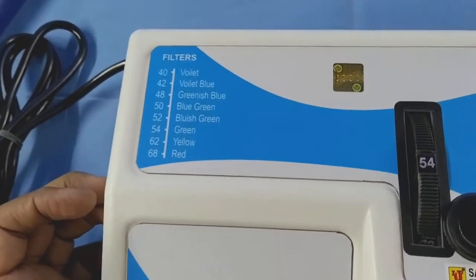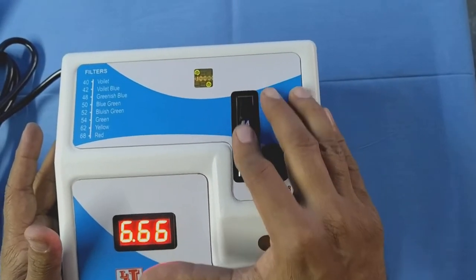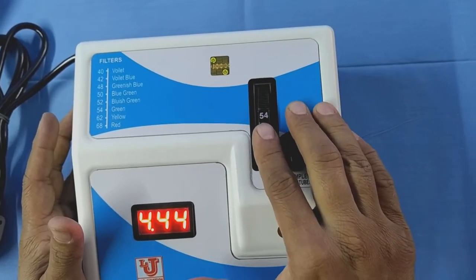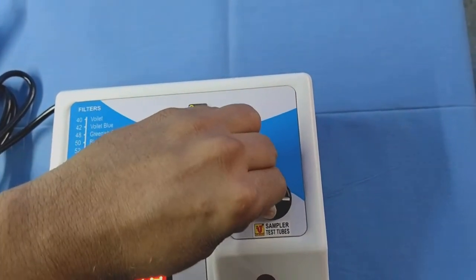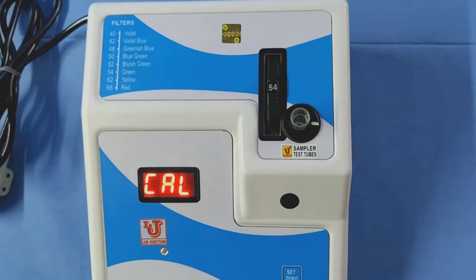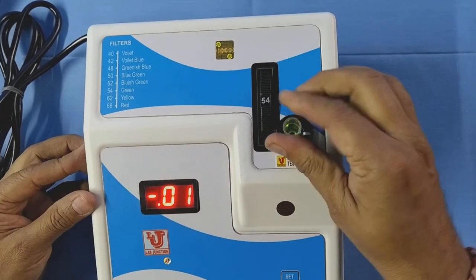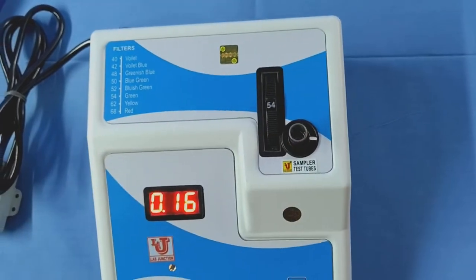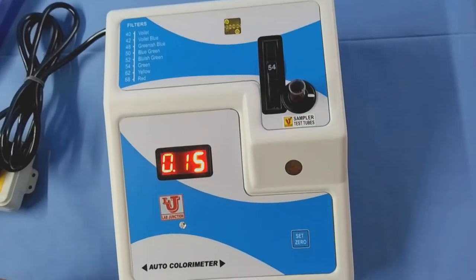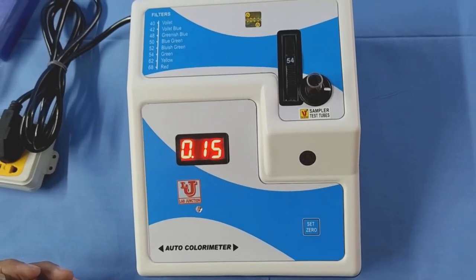Now, how could we use this colorimeter? First, switch on the instrument and select your, suppose, glucose filter 540. We want to do glucose from this colorimeter, 540. Now insert blank in the sampler test tubes and press 0 0. Now insert your sample, then the main reading in absorbance optical density shows on the display, then do your calculation.